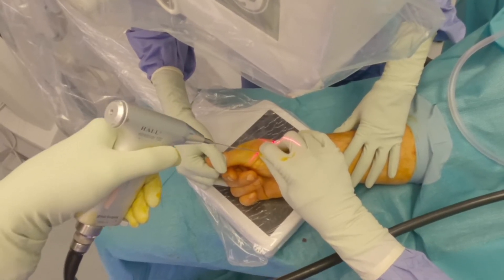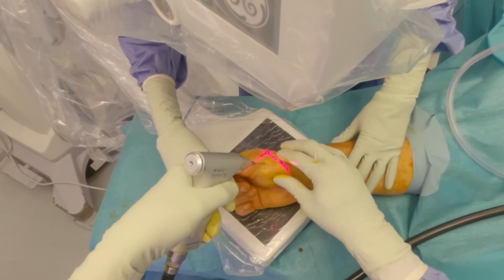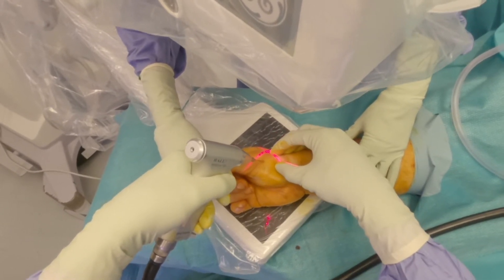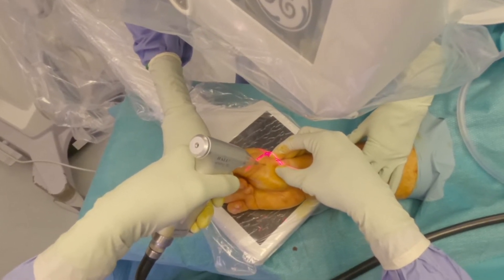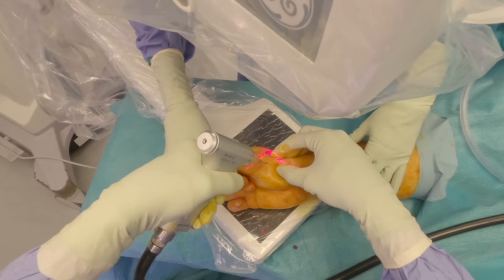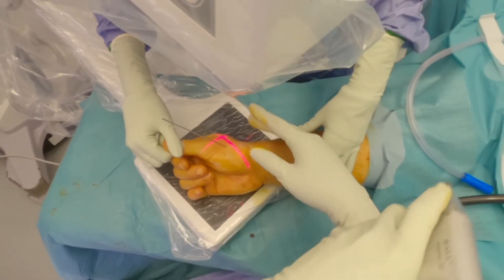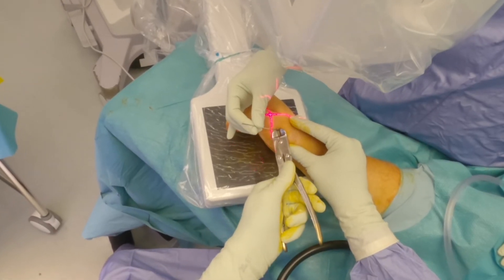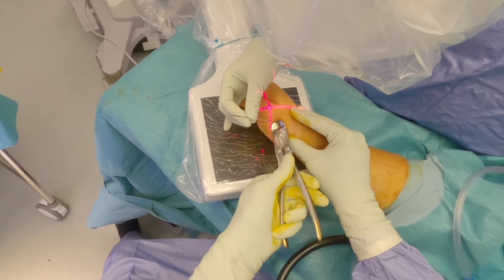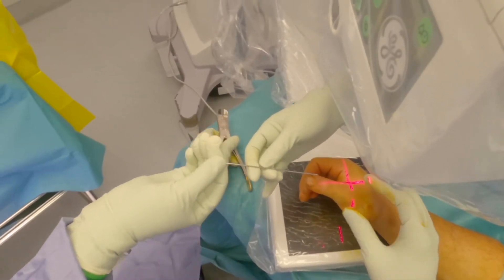The assistant applies longitudinal traction to maintain the reduction of the fracture while the surgeon drives the K-wire across the CMC joint. I prefer to use my other hand to palpate the CMC joint to check its reduction while driving the wire in, which also helps in visualizing the location of the trapezium while it isn't being x-rayed. If using a double-point K-wire, the wire can be cut and buried after satisfactory placement, and the other end used as a second wire.